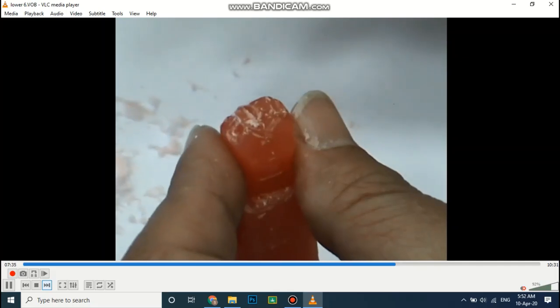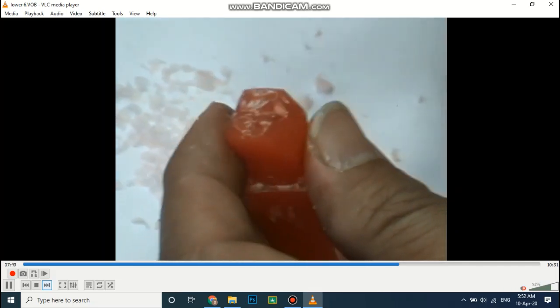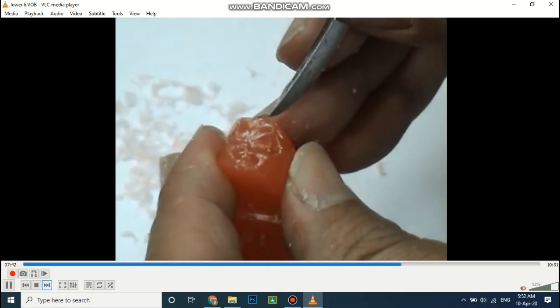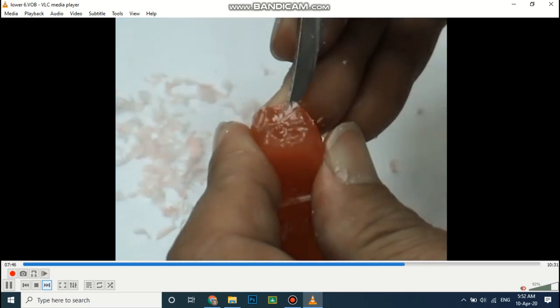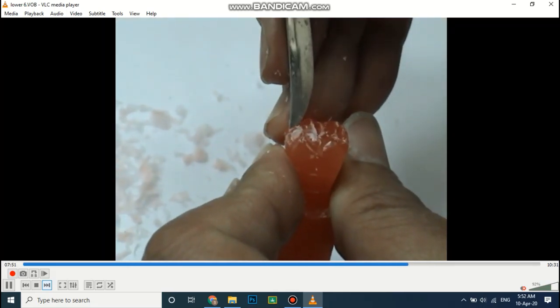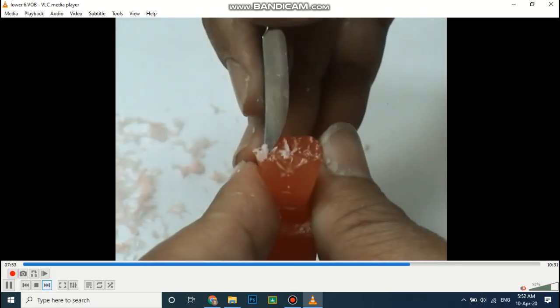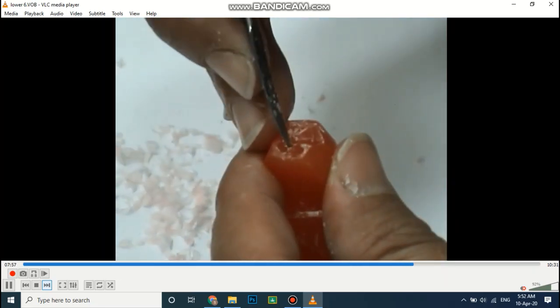The remaining cusp is the distal cusp, a very small cusp, with very gentle removal of the wax mesial and distal to it, as we have a triangular ridge distal to this cusp and a V-shaped reduction mesial to this cusp.